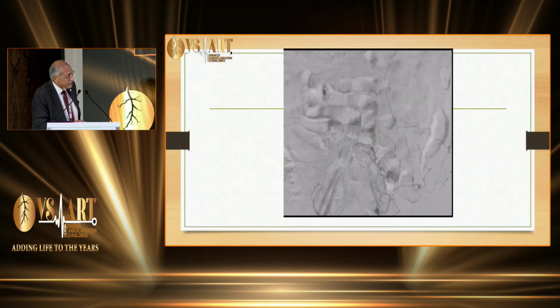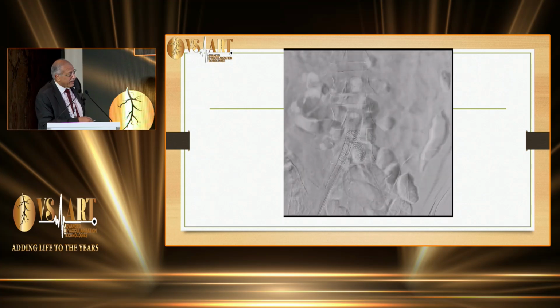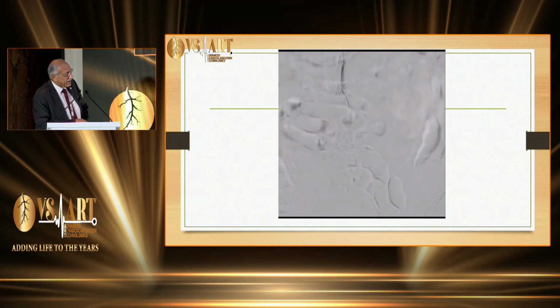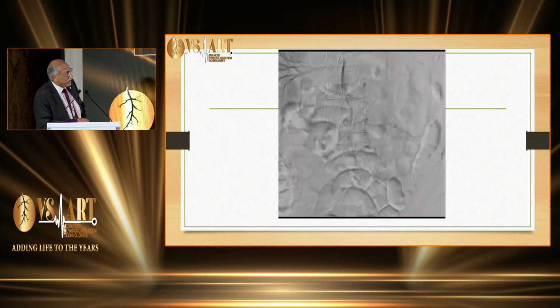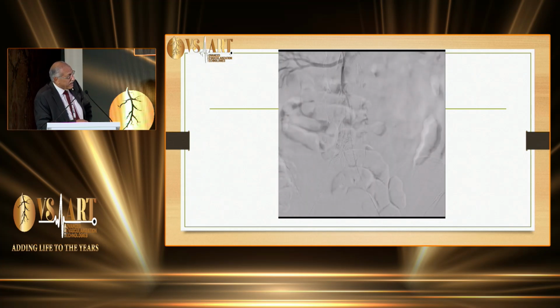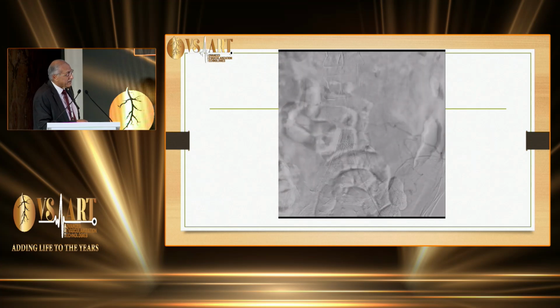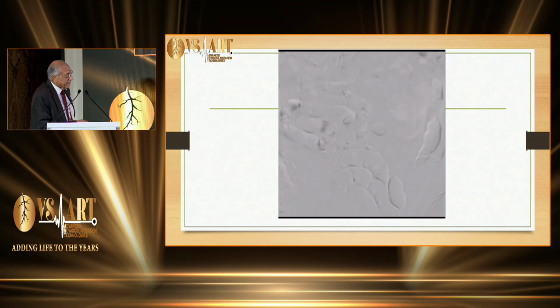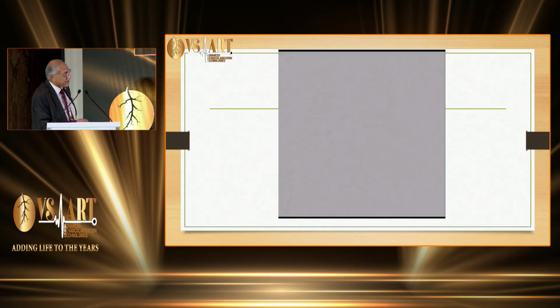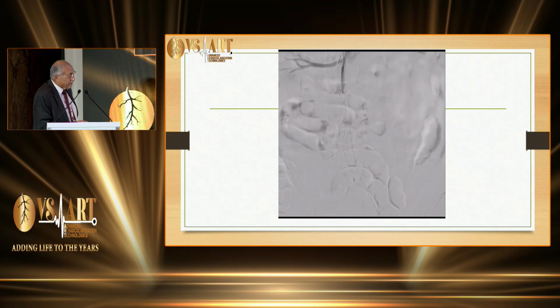We crossed the right iliac stent easily, and we were in the aorta, and we did the angio like that. Then we also crossed from the left iliac, but the strange thing is that we found ourselves in the subintimal space. You can see even the right renal is supplied from the subintimal space, and we were a little bit confused. Did we make this dissection, or was it done before?